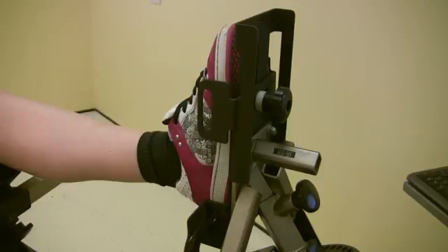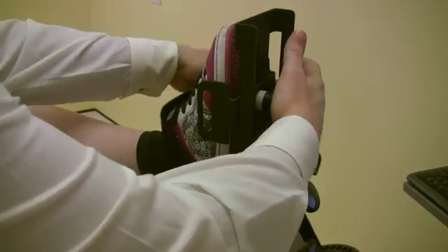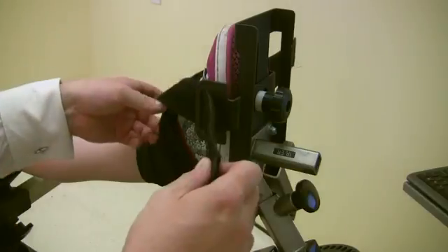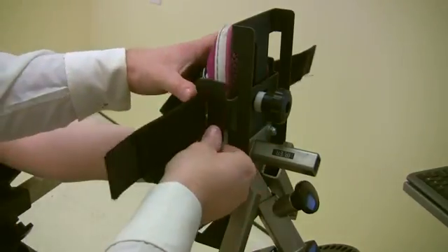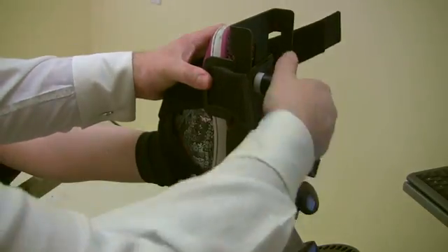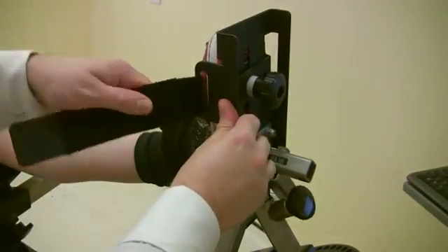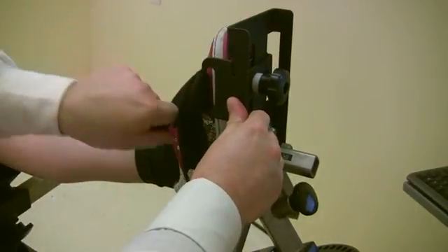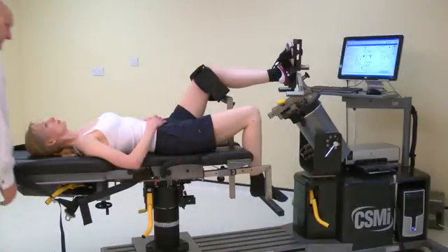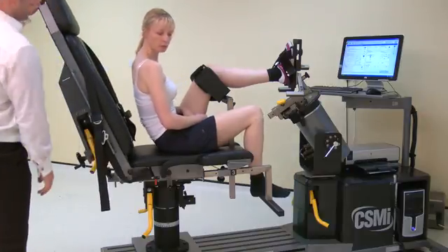To secure the foot to the footplate, start by loosely affixing the straps across the foot. Then adjust the strap points to the widest part of the foot. Pinch together, making sure they are firmly pressed into the foot, then lock in place using the screw. Finally, tighten the straps making sure to tighten the uppermost strap first. For subject comfort and to allow the subject to see the screen, the position may be modified by lifting the chair back angle.